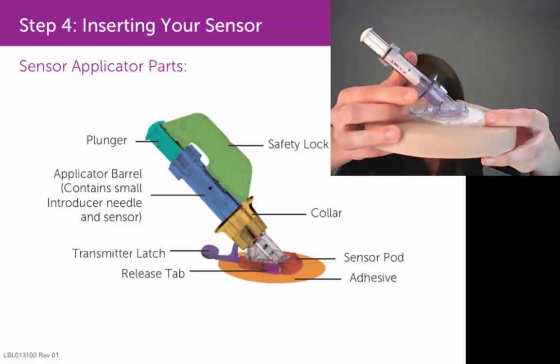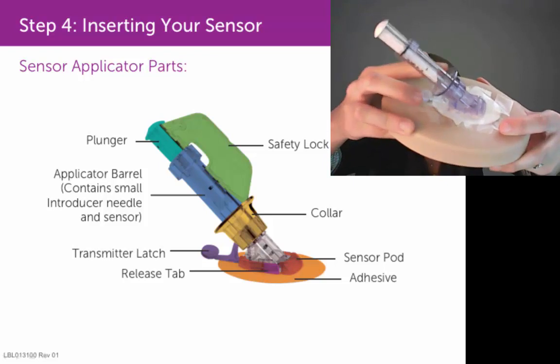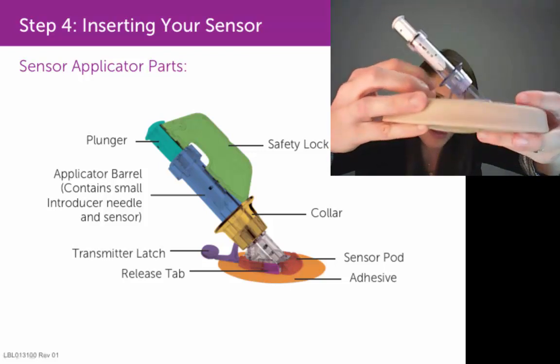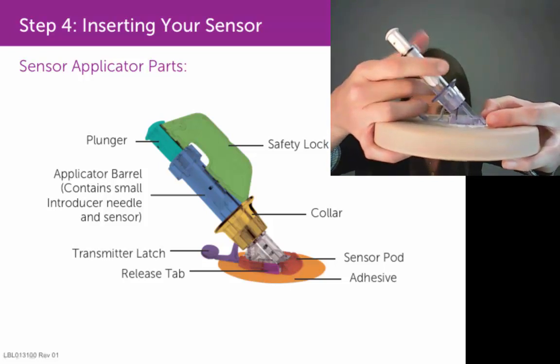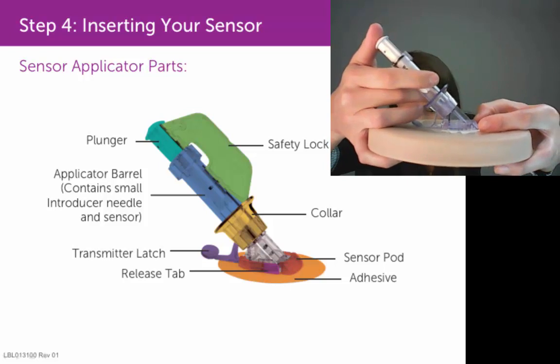This is where you want to be careful as to where you place your fingers. This piece here is called the collar — it looks like a circular rim that sticks out. You want to make sure that you keep your fingers above it. Place your index finger and middle finger above that collar and your thumb on top of the plunger.